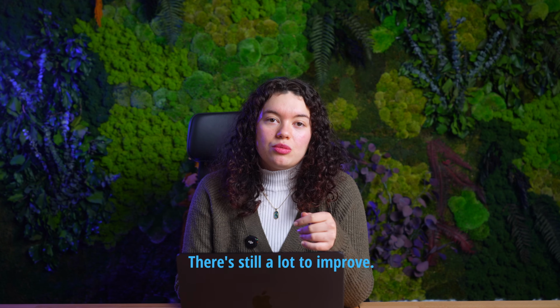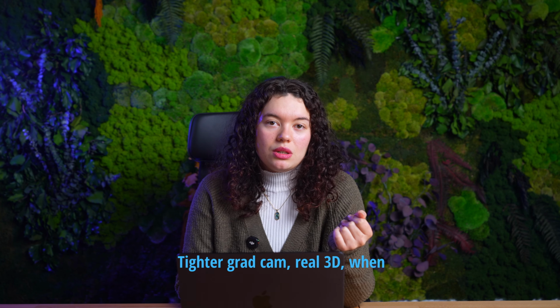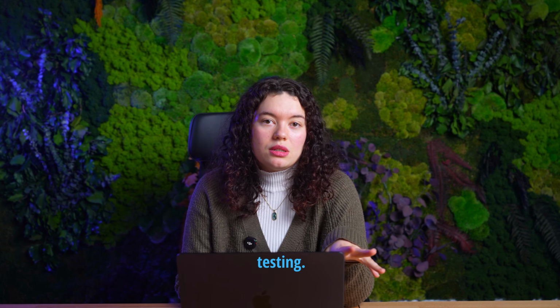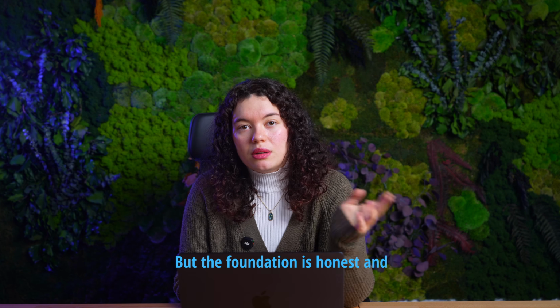There's still a lot to improve: tighter GradCam, real 3D when volumes are available, shorter explanations, and stronger testing. But the foundation is honest and inspectable.